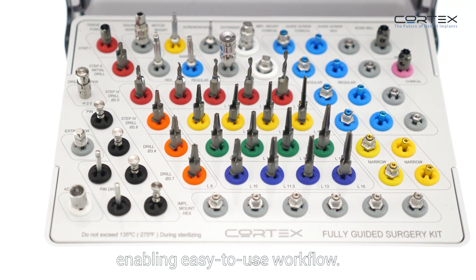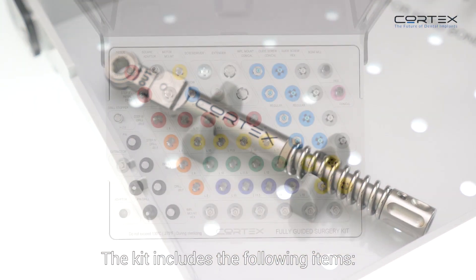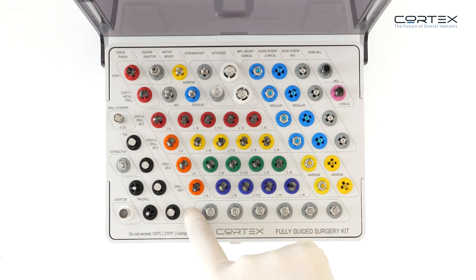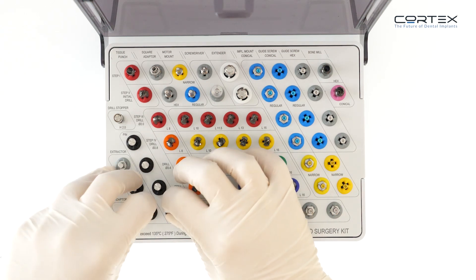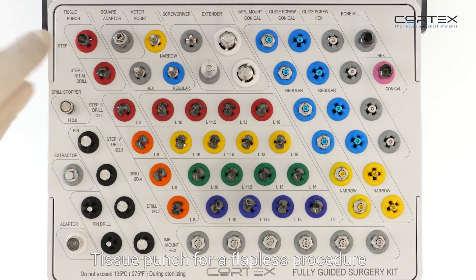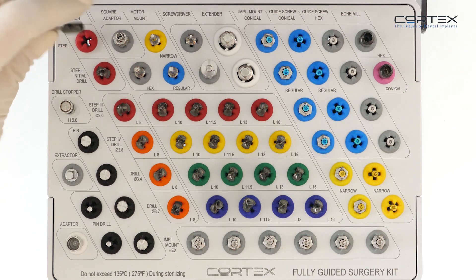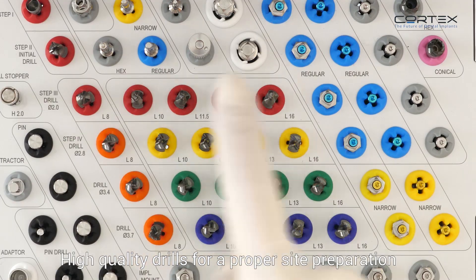The kit features an intuitive layout enabling an easy-to-use workflow. It includes fixation drills and pins, a tissue punch for a flapless procedure, and high-quality drills for proper site preparation.